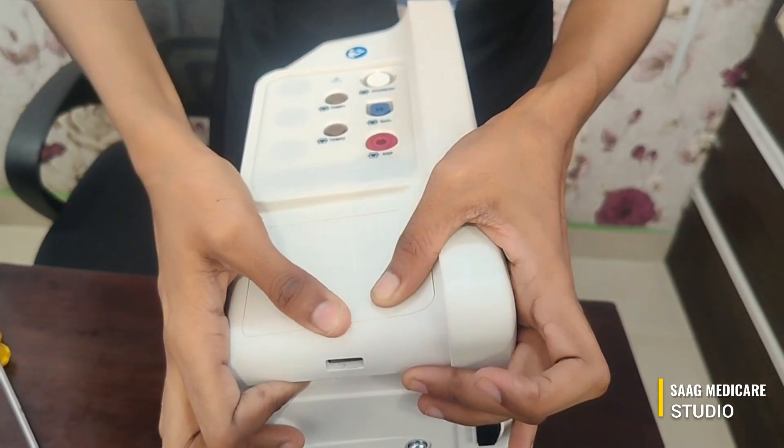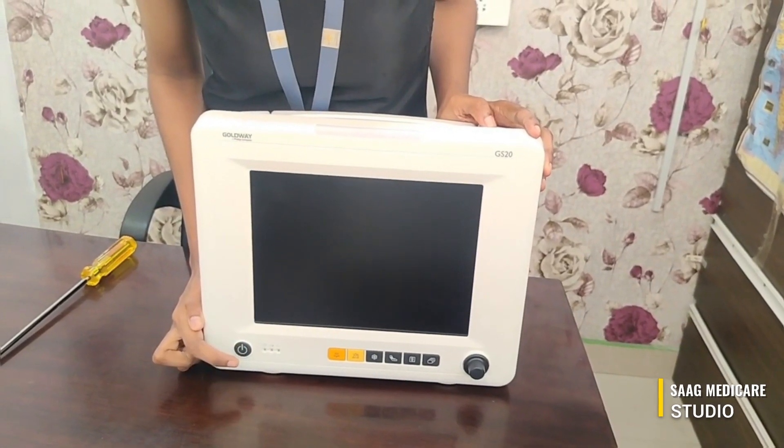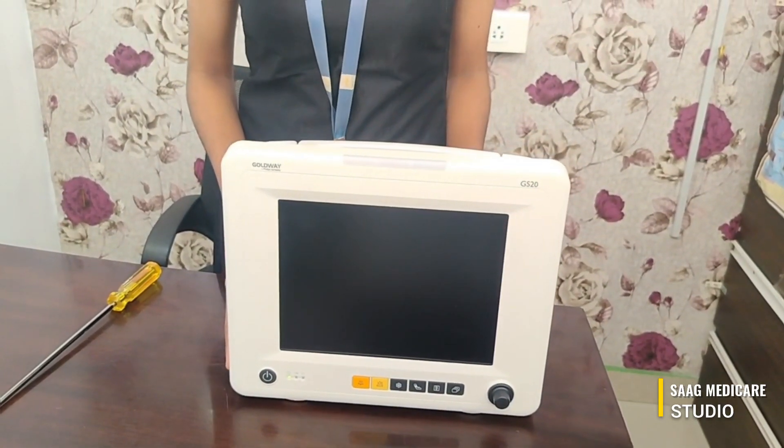Just press here. This is the on/off button — press here and the machine will turn on.